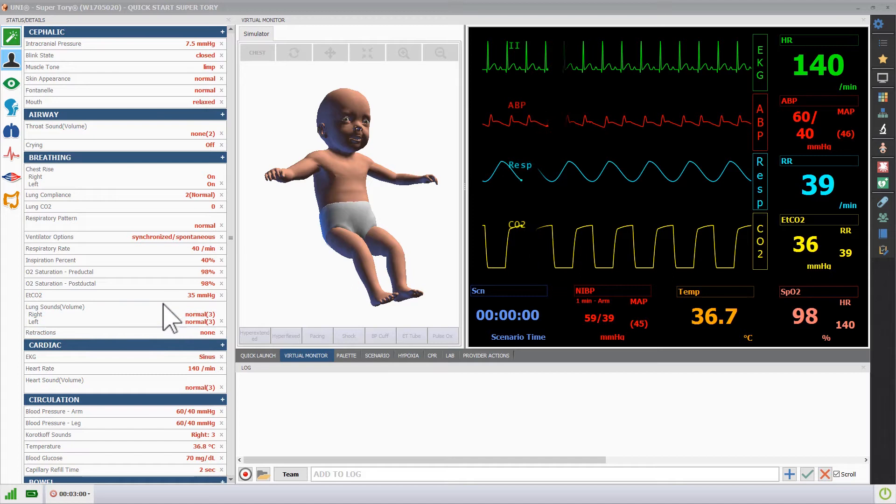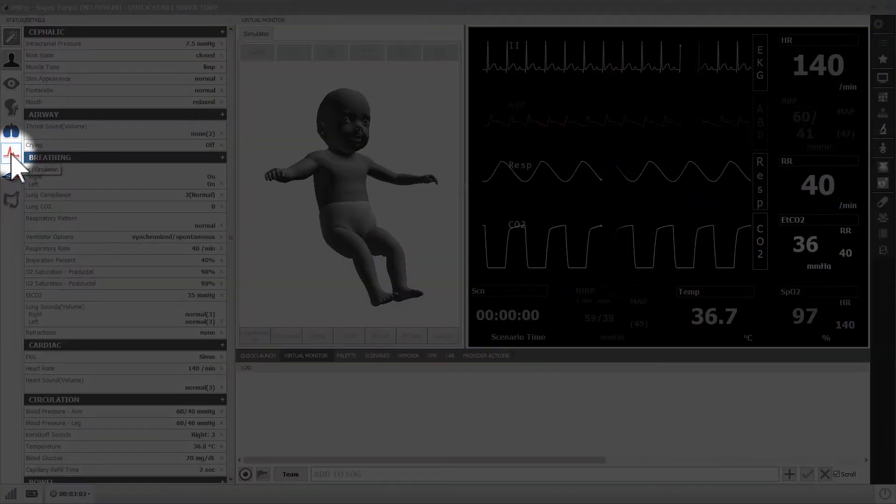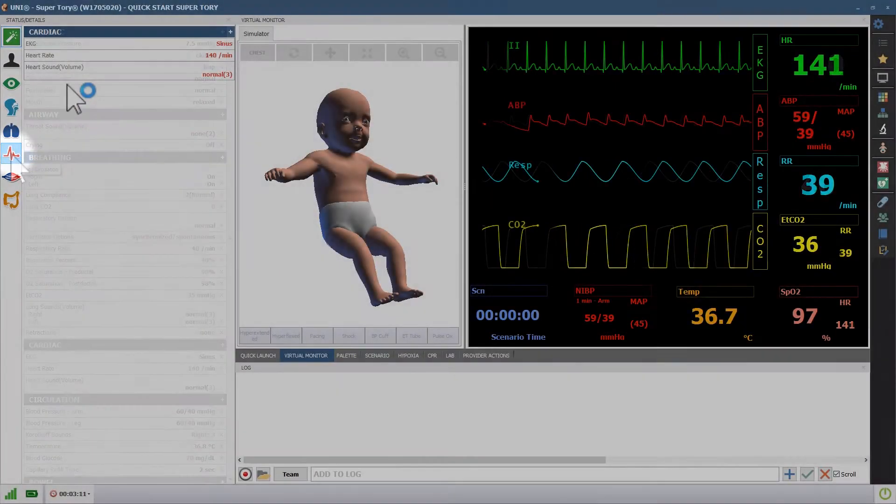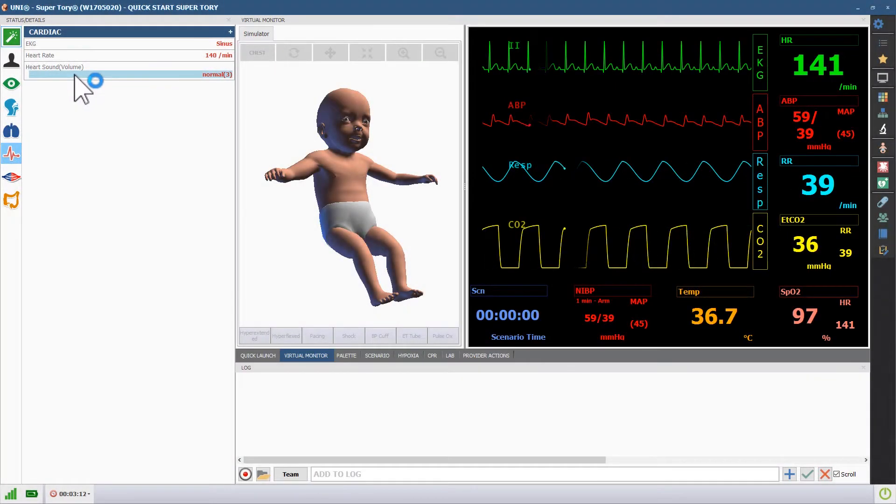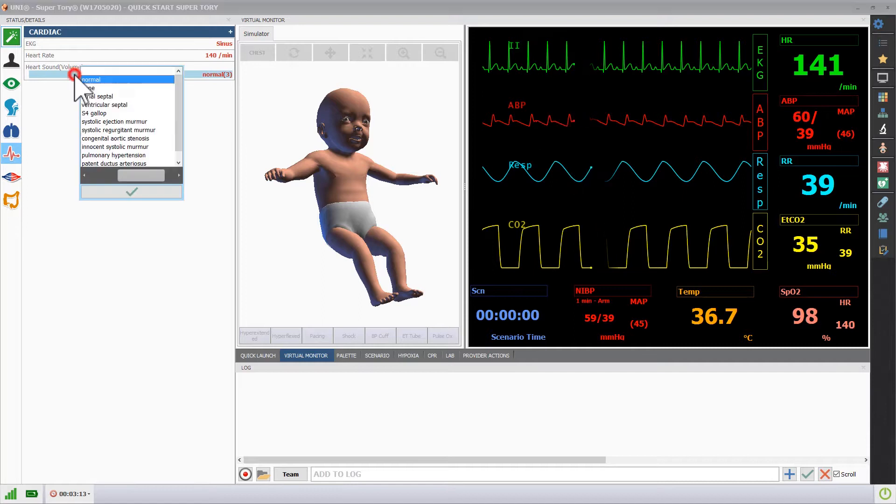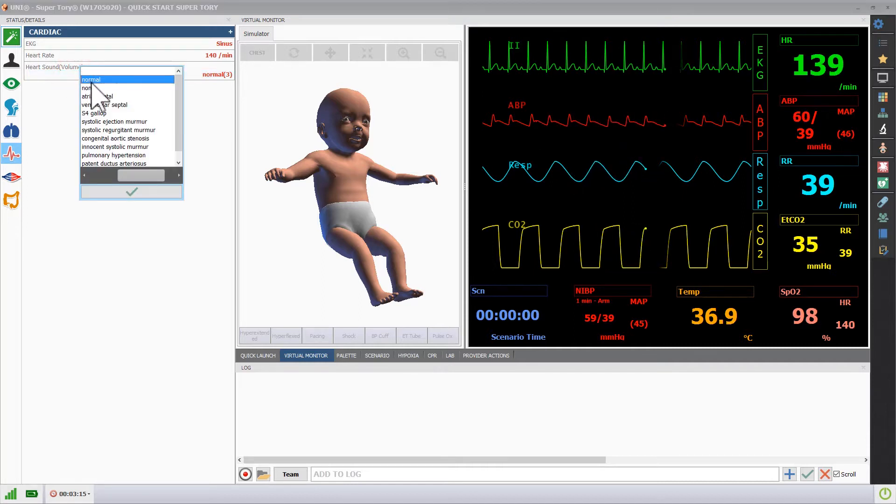To make changes to the cardiac features, open the cardiac submenu. Click the heart sound volume vital and select the desired heart sound.